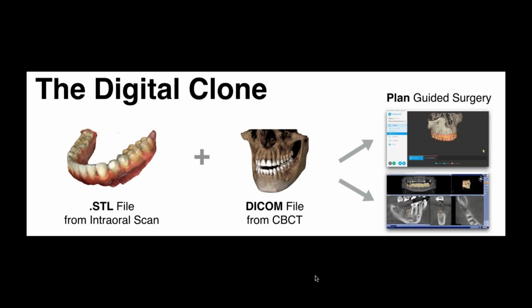And we have nowadays multiple different excellent implant planning softwares where we can really go to the finest detail on prosthetically driven implantology. And that's one of my favorite phrases, prosthetically driven, meaning that first I start with an ideal scenario of what I want to achieve regarding my prosthetics, an ideal digital wax-up. And from there, I look for an infrastructure for the implant, correct size, length, position to support that restoration.